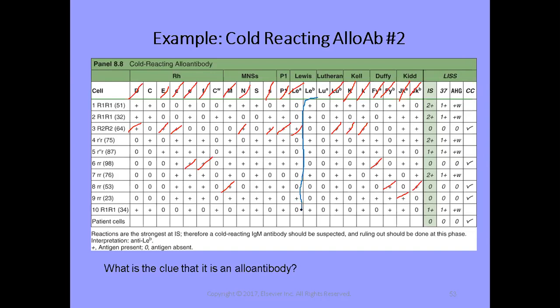And we know that anti-LEB is an antibody that typically does react. Oh, sorry, I'm really drawing badly. Positive here, positive there. Positive, positive, negative, negative. Positive and positive, positive and positive, negative, negative. It's a perfect pattern match. And we know that these Lewis antibodies typically do react at, they're considered cold reacting antibodies.